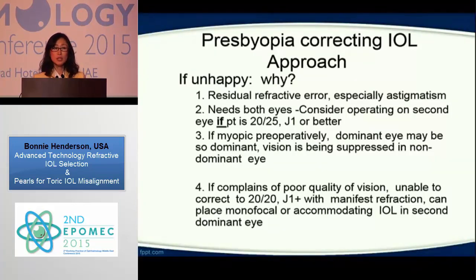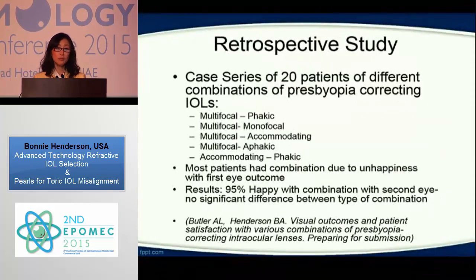We did a little study. This is non-published at this point, but we looked at all the unhappy patients. So we looked at all the patients who came to us, either my own unhappy patients or people who were referred to me who are unhappy. And we looked at all the different combinations where they were multifocal, monofocal, multifocal, accommodating, all the different combinations.